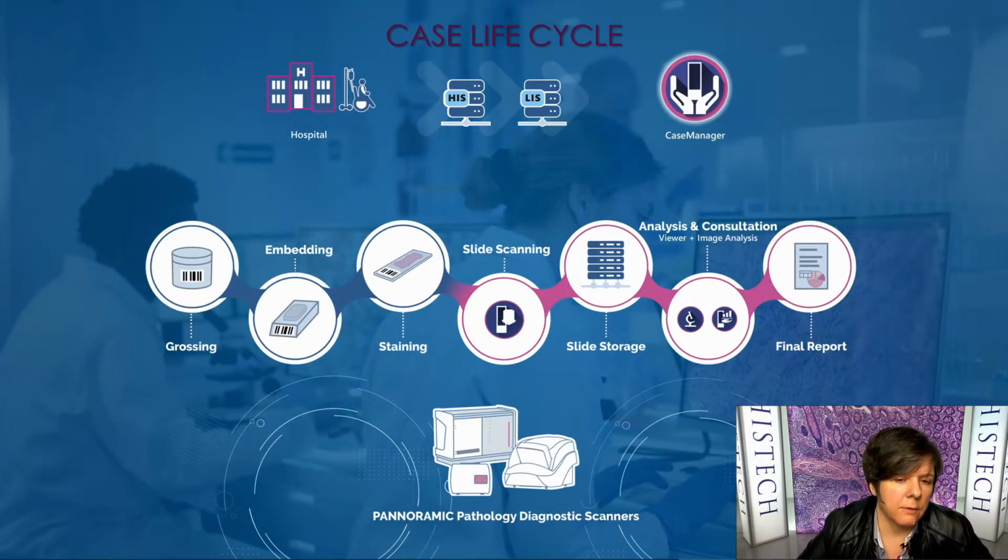When the patient arrives at the hospital, their personal data are recorded. If the sample of a patient must be examined, the data is transferred to the laboratory information system, or LIS. In the case of the pathological examination, the case manager will receive the patient data from the LIS. The case manager pairs the digital slides with the patient data, but it is also able to follow up the stages of sample processing.